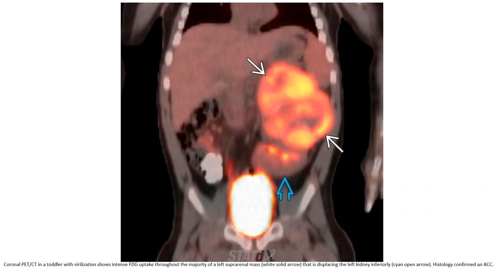FDG PET-CT in a toddler with virilization showing FDG uptake throughout the majority of the left suprarenal mass, which is displacing the left kidney.